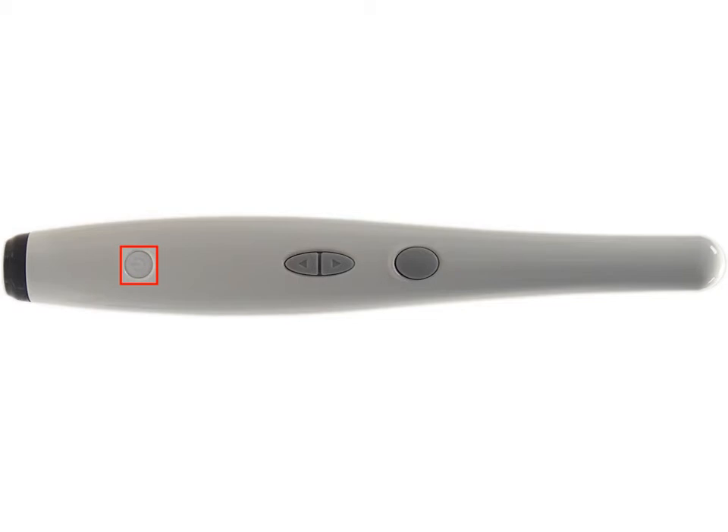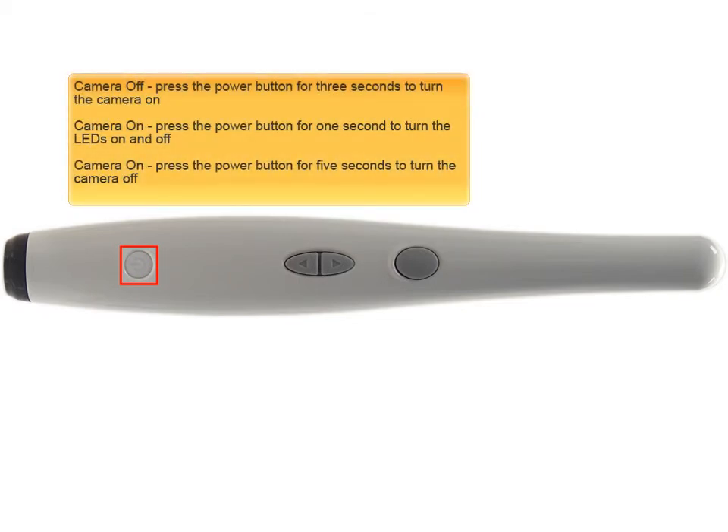The last button is the power button. If the camera is off, pressing the power button for three seconds will turn the camera on. If the camera is on, pressing the button for one second turns the LEDs on and off. If the camera is on, pressing the button for five seconds will turn the camera off.